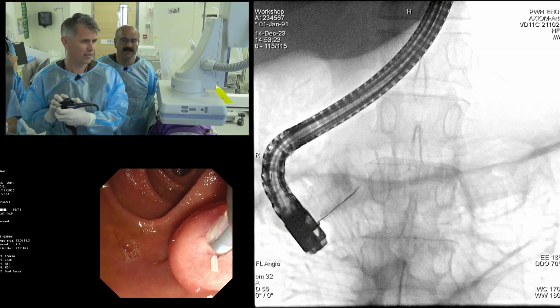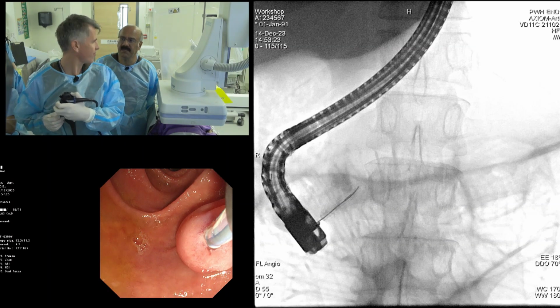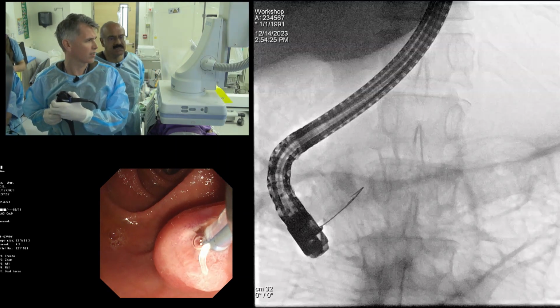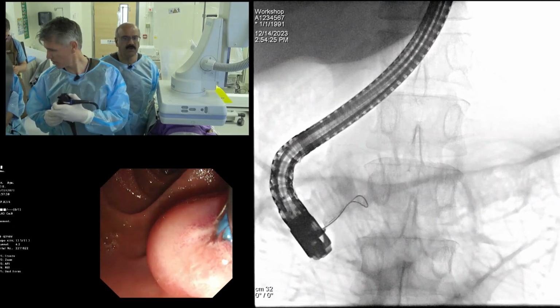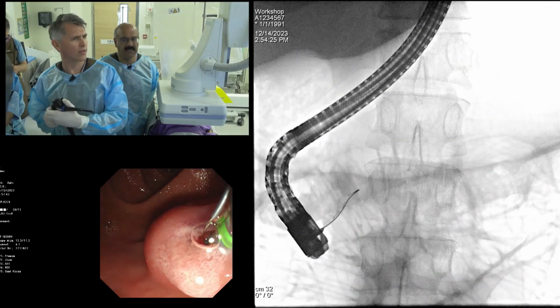Yeah. You can fragment the stones. The duct will then straighten a little, and then the rest of the therapy becomes easy. I think this is the way to go. In India, you will do the ESWL first, or you do the ERCP first? First the ESWL, you don't do the ERCP. In a case like this, after the MRCP, the patient will go for ESWL, and then we do the first ERCP after the ESWL, because then you can clear everything by that time.